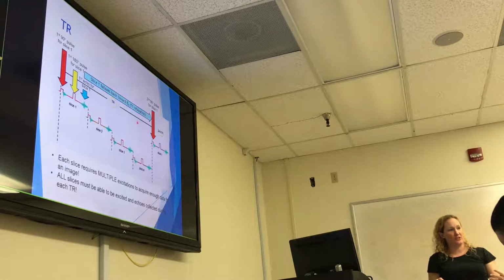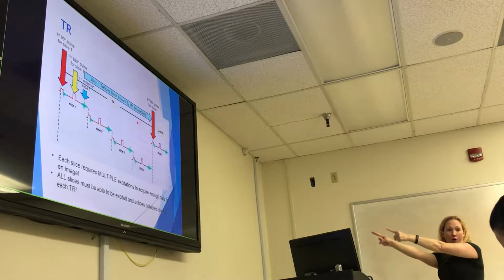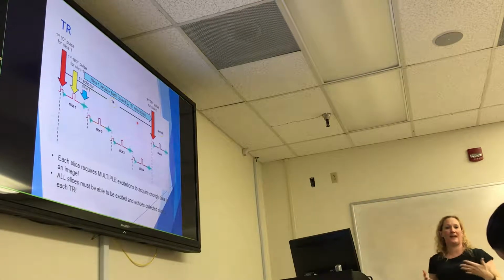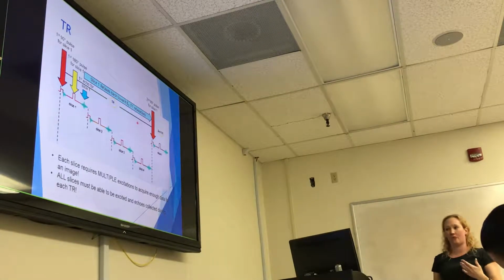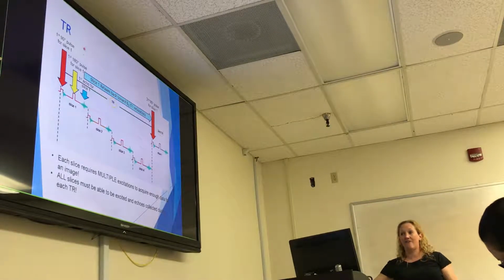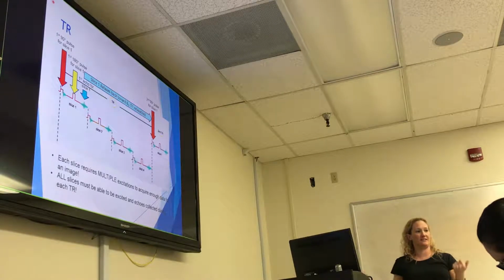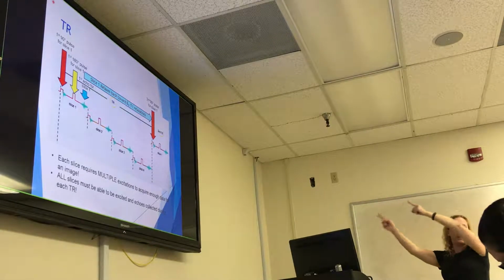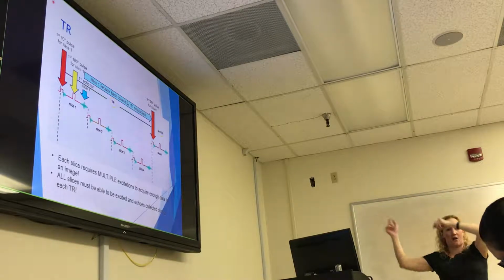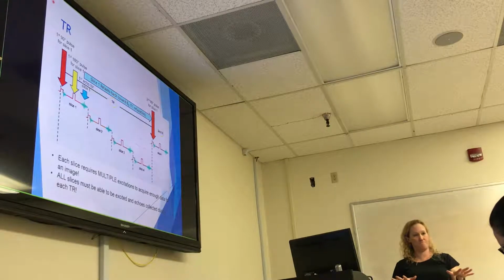And so as we've established, we need that time period to be short, right? Because if we wait too long, our tissues are all going to be relaxed back and there won't be any difference between them. So for a T1 weighted, that's why our TR is the factor that controls our T1 weighting, because how long we're waiting before we come back to the slice determines how much T1 difference there is in the tissues. With me so far?